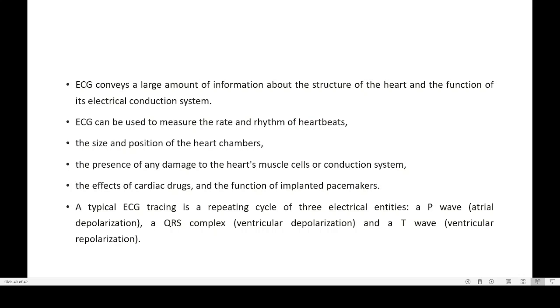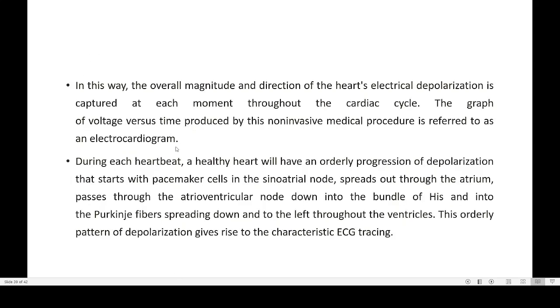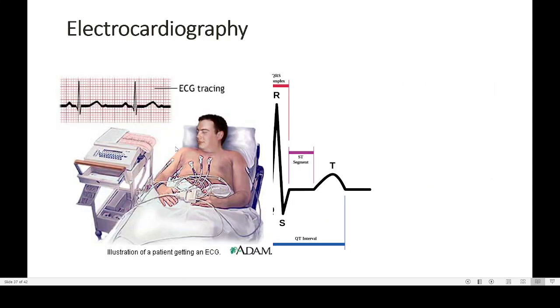here there are a number of diseases. In a number of diseases, you can see the variations in the ECG. So the normal ECG pattern is this way. This is the normal ECG pattern. And any variation in that ECG is a sign that something is going abnormal. So here, instead of the spike in the upward direction, what we are seeing is the spike in the lower direction. This is another, because of some sodium ions being blocked.